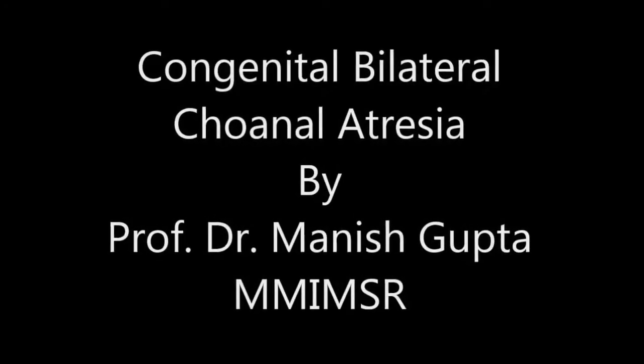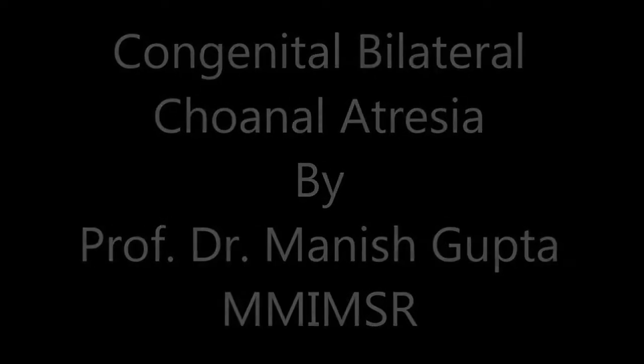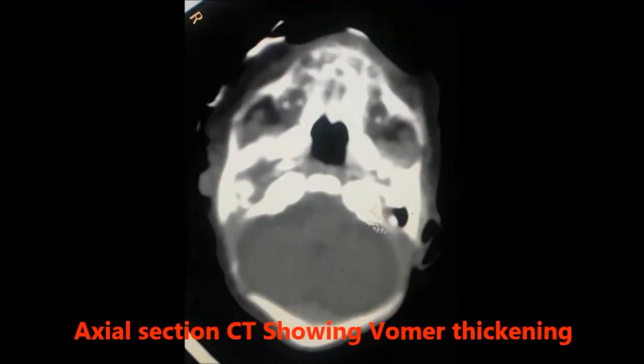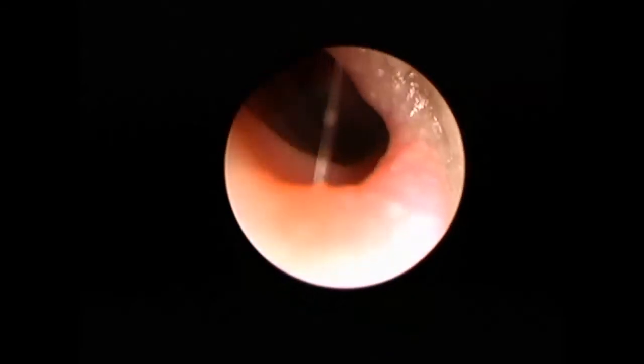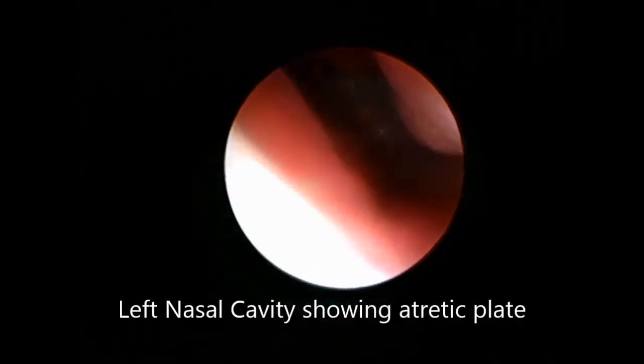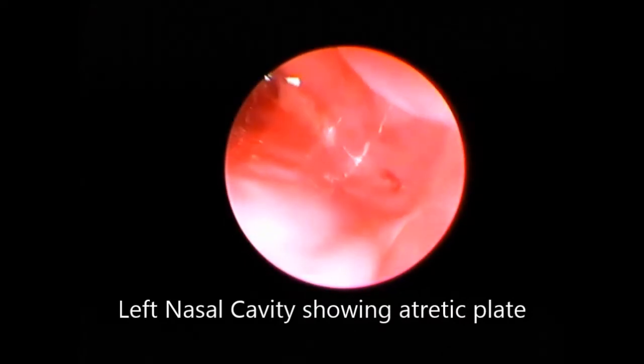Hello everybody, I am Dr. Manish Gupta, professor in the department of MMI-AMSR. The case we are presenting here is congenital bilateral choanal atresia. You can see in the axial section the bony atretic plate on both sides. A radiopaque dye was also injected into the nasal cavity, which was shown held up, taken up for trans-nasal endoscopic re-canalization of the choanal atresia.